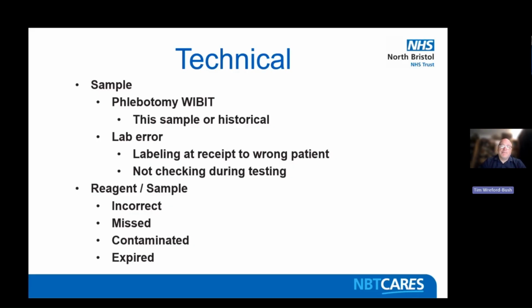Have your reagents expired? So this is all good laboratory practice, checking, recording, just making sure. Never presume that what you've pulled out of the rack, or the sample you've picked up, is the sample you're expected to be. Always make sure that it is what you think and expect it to be.